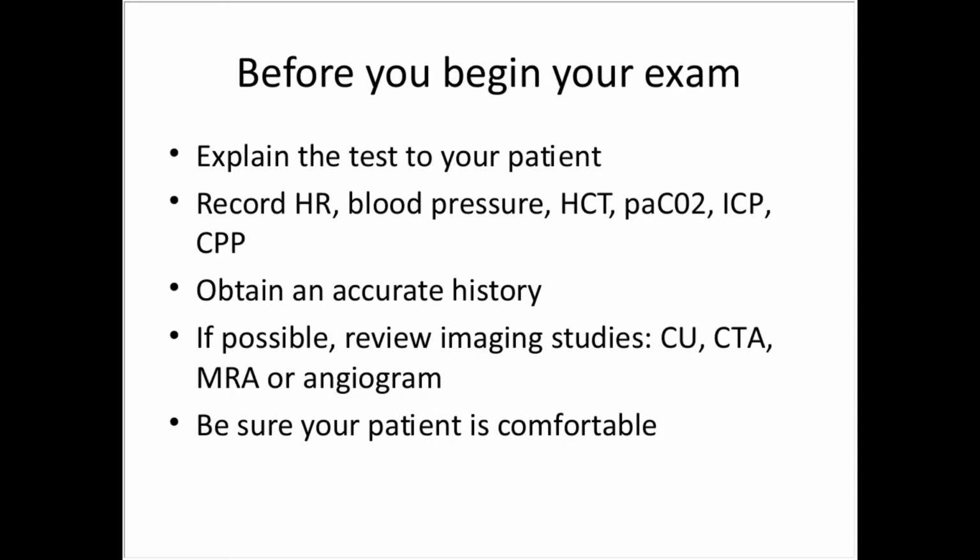So before you begin your exam, explain the test to your patient. Tell them how long the exam's going to take. Tell them that you're going to use some cold gel and they're going to hear their heartbeat. Record their heart rate, blood pressure, and hematocrit. And if you're in an intensive care unit, you may have PaCO2, intracranial pressure, and cerebral perfusion pressure available for your charting. All of these values will affect your exam.